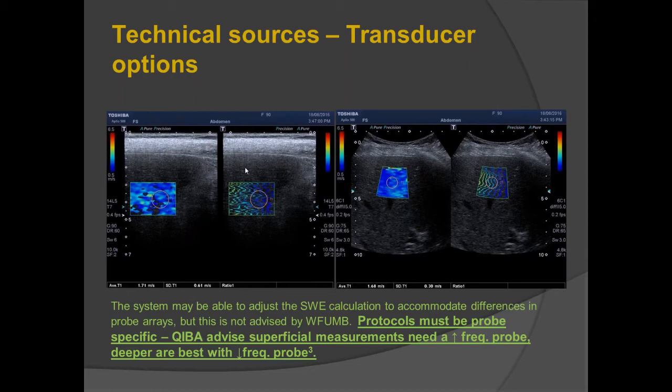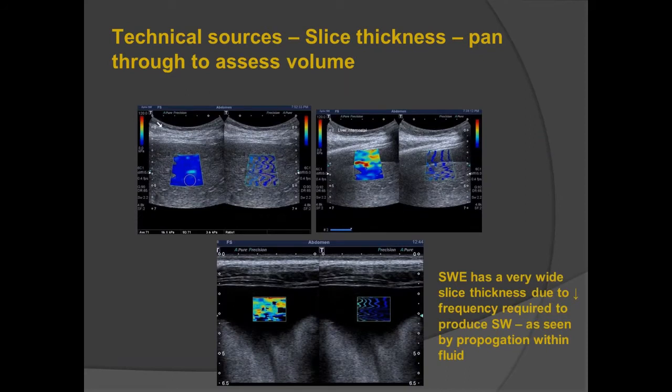If you're using ultrasound for superficial parts, you should be using the linear probe. And that's what their recommendation is. And quite honestly, we have strayed away from using the linear probe anyway for livers because rarely do you get a great result, and that would be our recommendation. So abdo probe for livers, even if it's a thin patient, use the abdo probe.